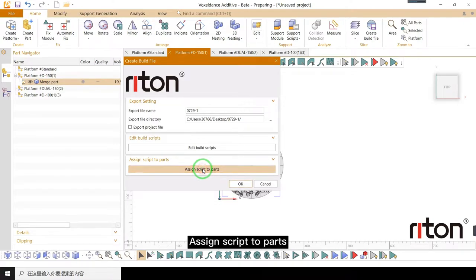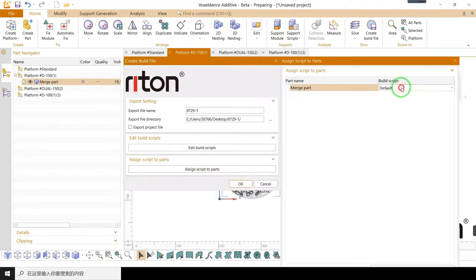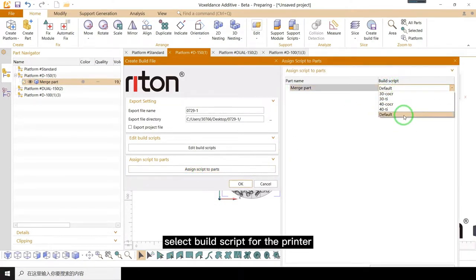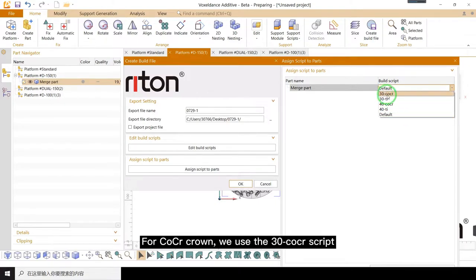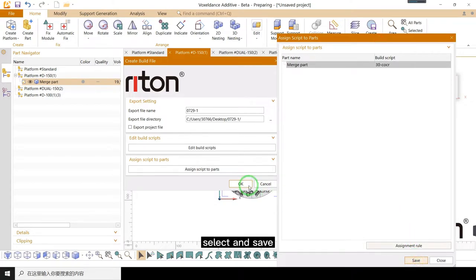Assign script to parts. Select build script for the printer. For cobalt chrome crown, we use the 30 cobalt chrome script. Select and save.